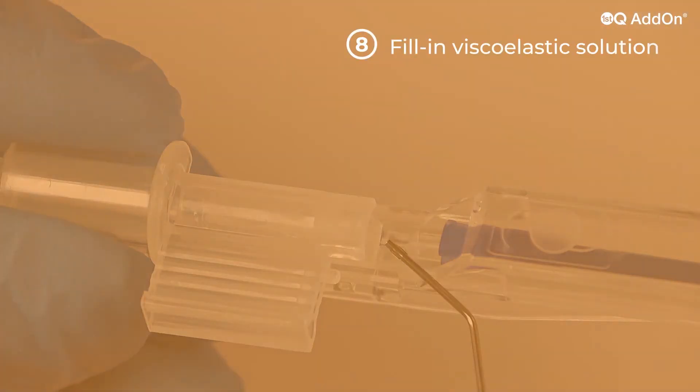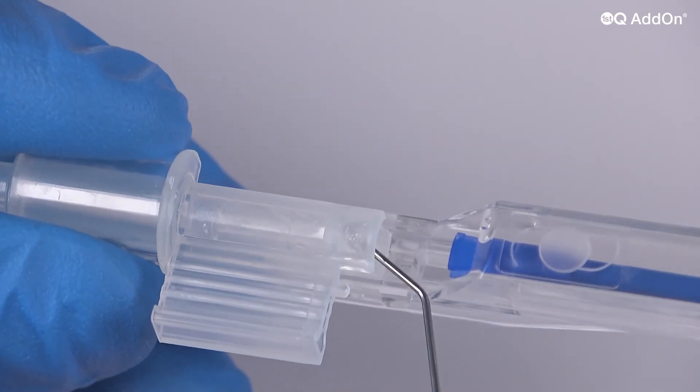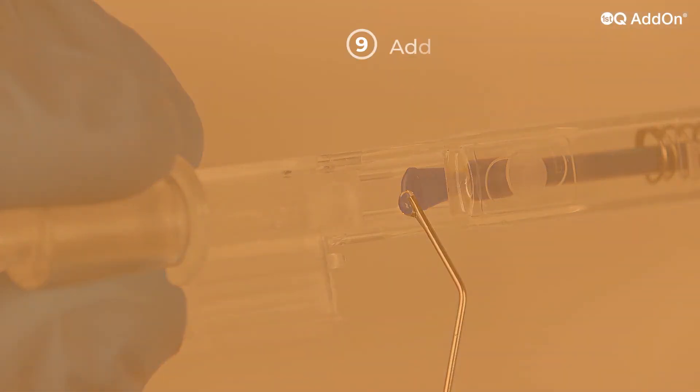Fill in viscoelastic solution from the back of the loading chamber without touching the IOL. Add a drop of viscoelastic on the plunger tip.